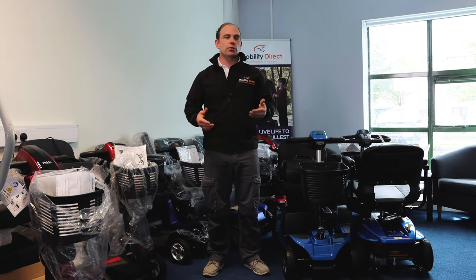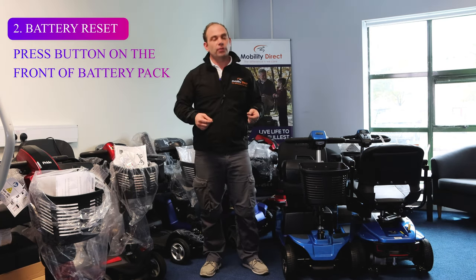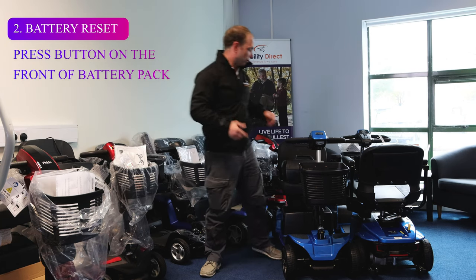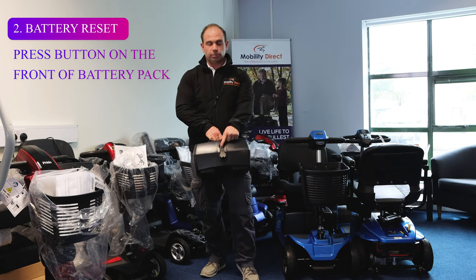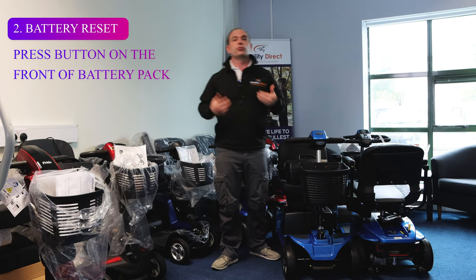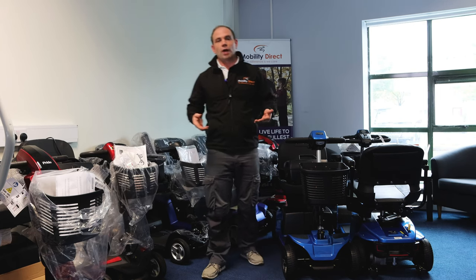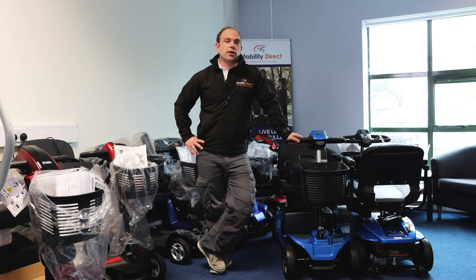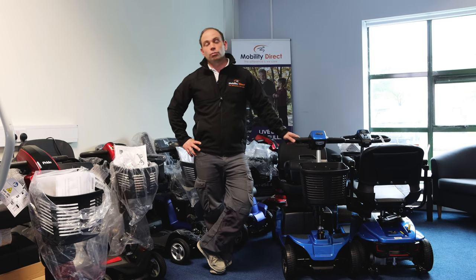Number two: if your mobility scooter just suddenly stops out of nowhere and you can't turn it on — it's completely dead with no battery lights — check the battery reset button on the front of the battery pack. This depends on the manufacturer, but in the case of Pride, you usually have a white button very close to the charging port, and you press that button in to reset the battery pack. These battery packs have a type of trip switch — if you're driving up a steep hill, over gravel, or accidentally drive off a curb, that can put the batteries under too much strain and the trip switch will activate to protect the batteries. Just press that button in to reset it.